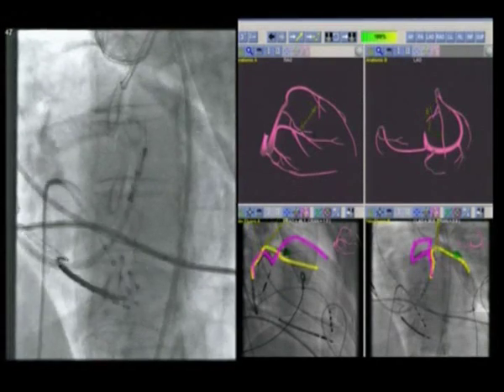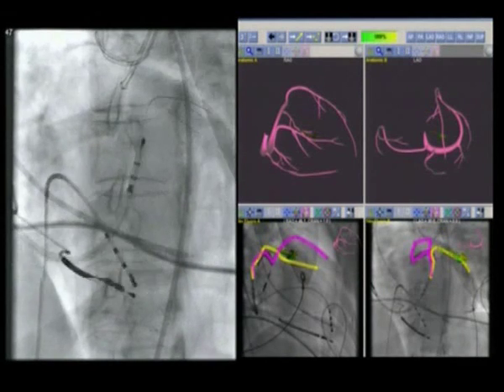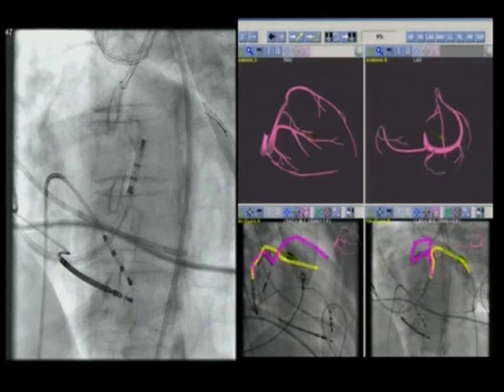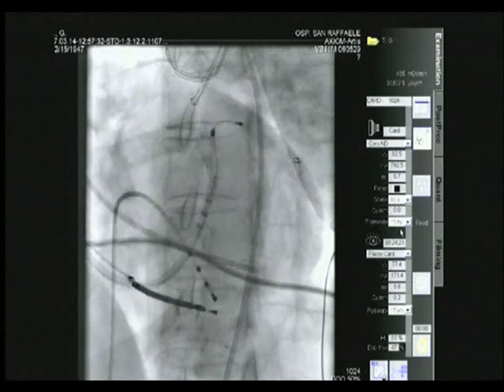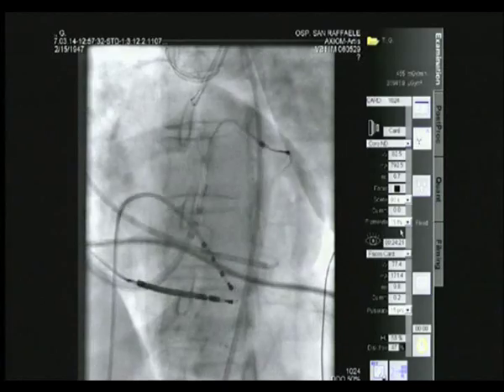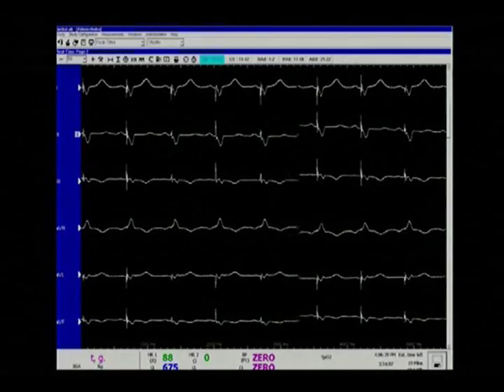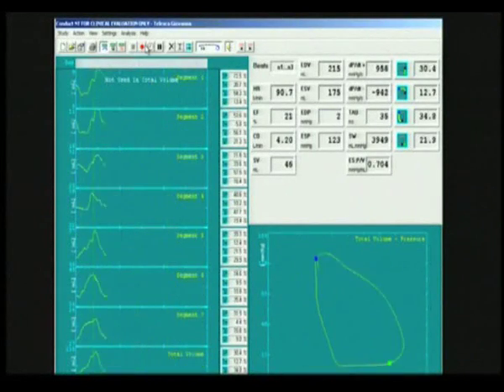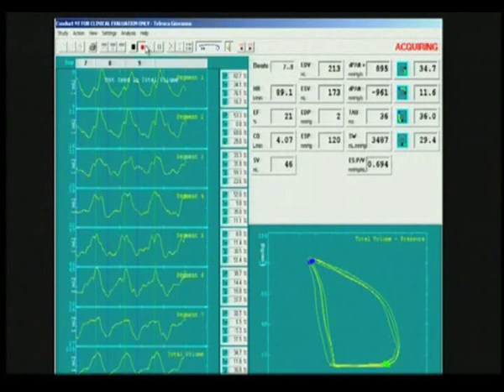Now we will assess whether a more proximal mid-basal position of the same lateral branch may result in greater hemodynamic improvement. The magnetic tip is steered and navigated into the lateral vein to the desired target. After the guide wire reaches the desired position, the lead is pushed to reach it. The left stimulation from the mid-basal position results in the same QRS-based morphology as in the previous apical position. However, PV loop analysis showed that the hemodynamic response, despite similar electrocardiographic changes, is different in this position. The sequential volume channels from apex to base are aligned as before, but the PV loop area is smaller and stroke volume and dP/dT are lower than at the lateral apical position.